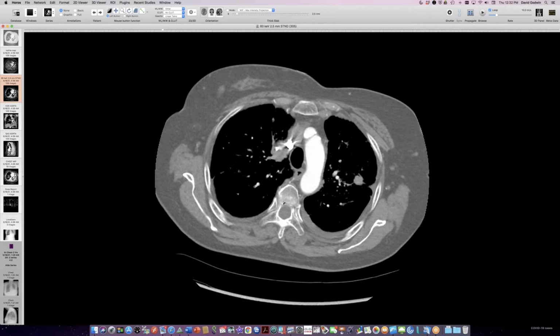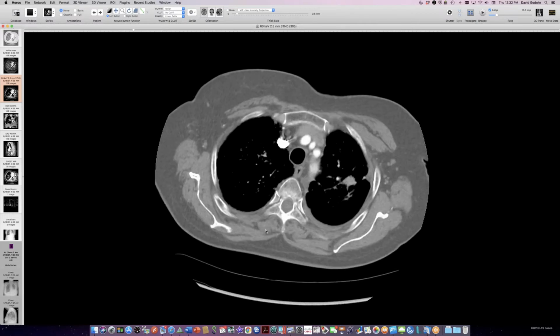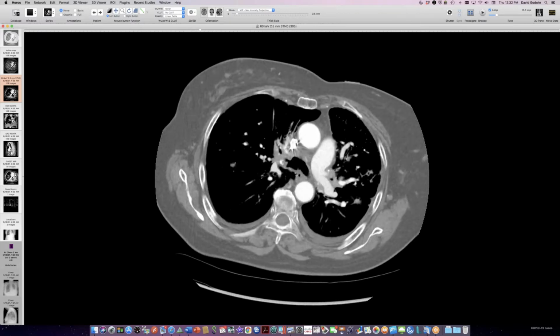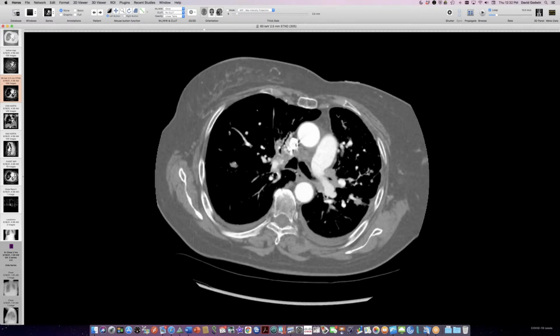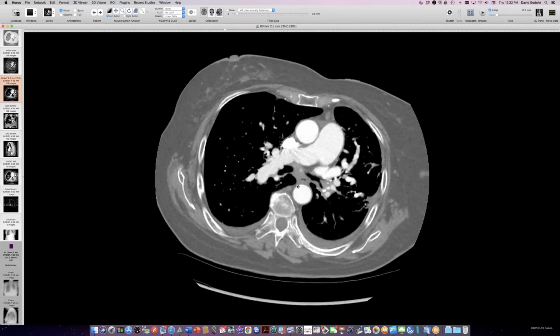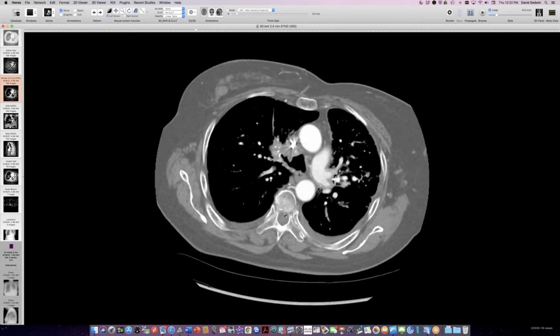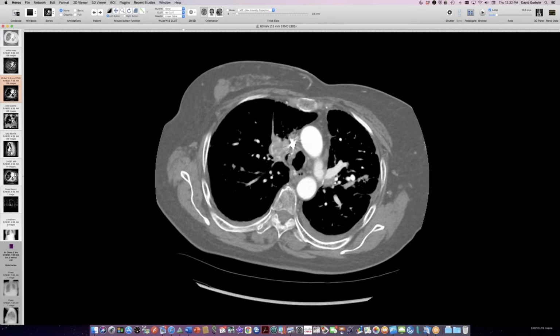But typically the veins go first, then the arteries, then the airways. Definitely, the most common vessel that's affected is the superior vena cava. So that's the most common, and then any soft structure, pulmonary veins, airways, and arteries can also be involved. I've seen a number of cases though, Jeff, that just had modest calcifications like this and didn't have a big particular blob. And there's obviously a lot of scar tissue here.